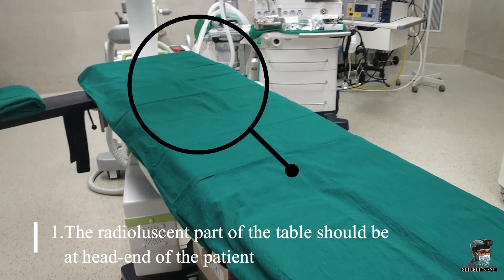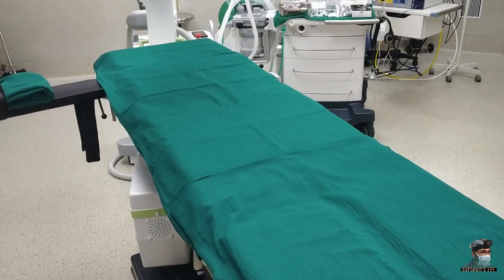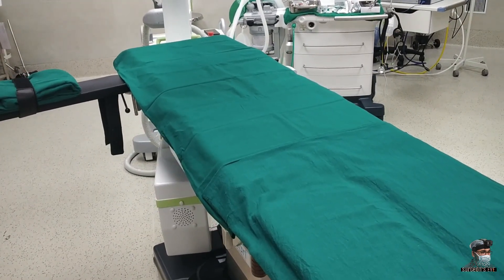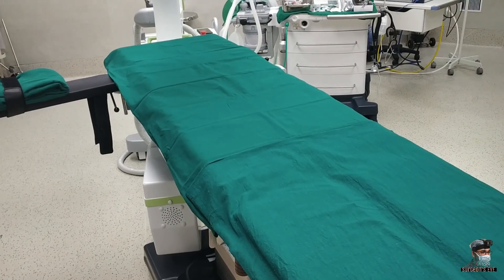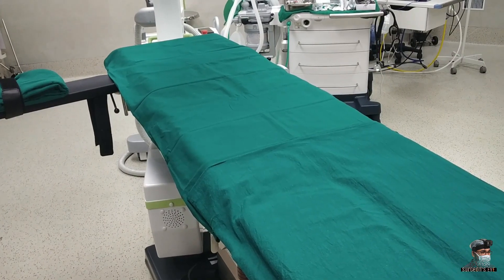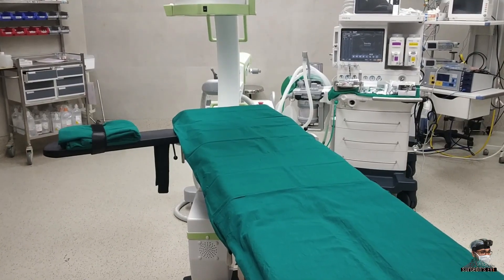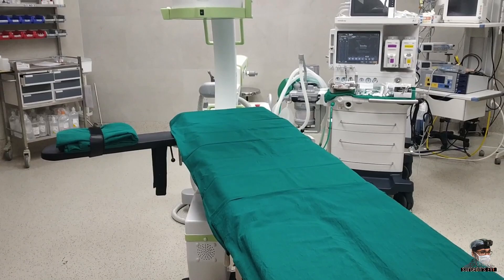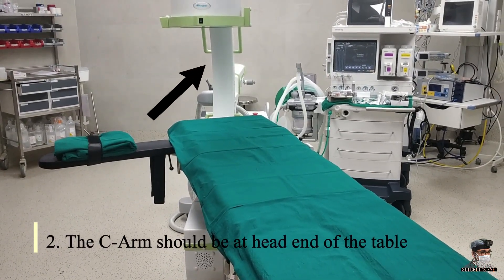The first thing is to have the radiolucent part of the OR table at the head end of the patient. In some tables it requires turning the table 180 degrees to achieve this. In some tables, if the frame comes in the way of taking images, it is advisable to remove that part of the table and to place a radiolucent armboard to achieve unhindered images of the shoulder.